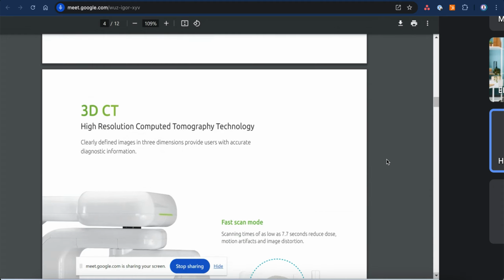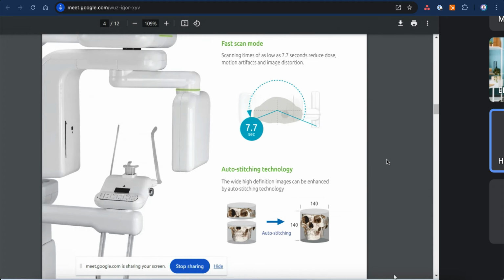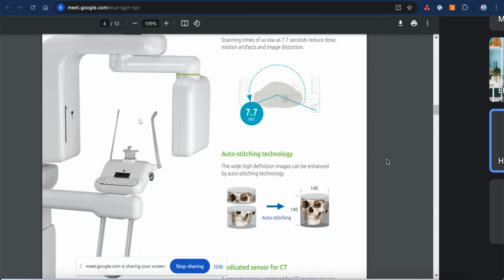So we'll start here with the CBCT. CBCT, I use it here, three dimensions. Accurate diagnosis, here. How is CBCT done? Like, you put your head here, and then this device, this one here, and this one here, does 360 degrees around your head, so it can get the 3D image of your face.